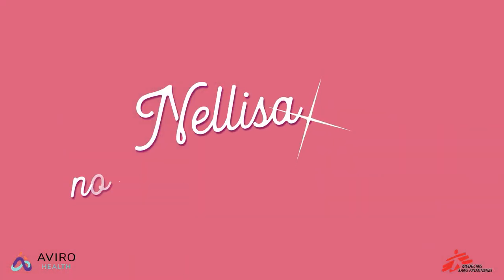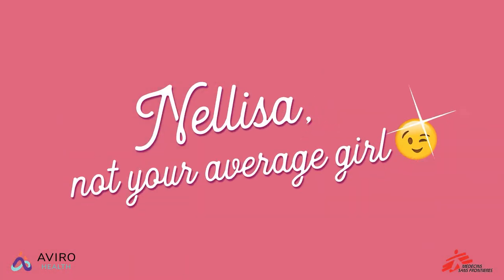Hey ladies, Nellisa — not your average girl — here, and today I'm going to show you how to use the female condom. Now Nellisa knows that sometimes a girl needs to get down, but I also know how to stay safe. So me and my plastic vagina here are going to show you exactly how it's done.